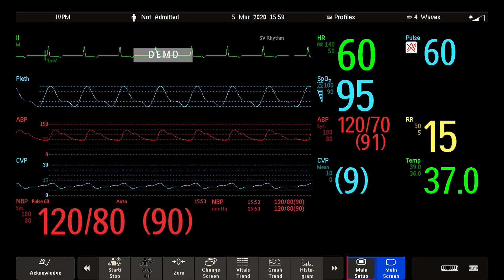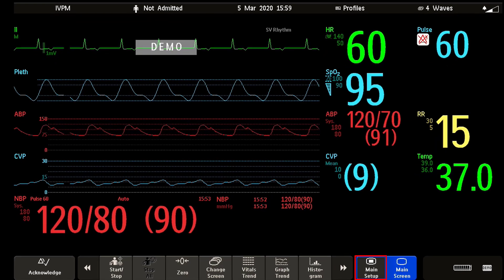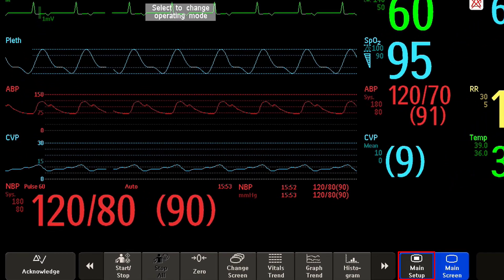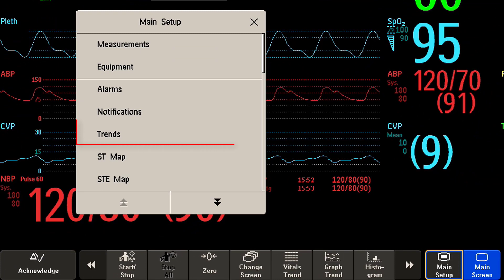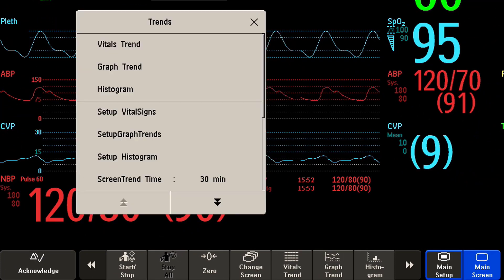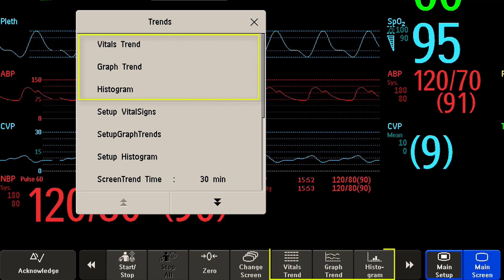To open a trend window, select the main setup key and then trends, and then select the trend you want to view, or you can just use one of the dedicated smart keys.